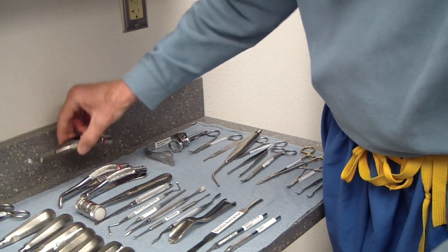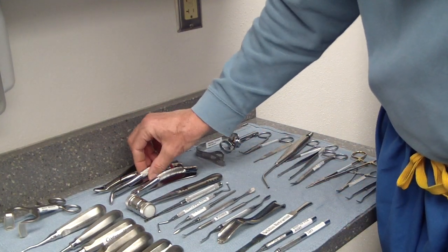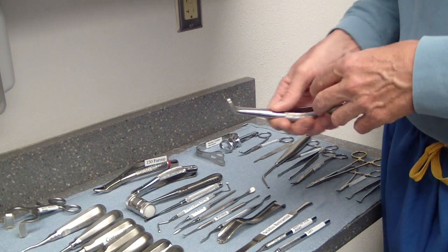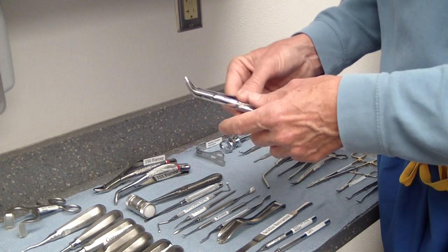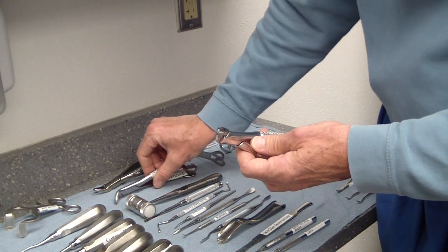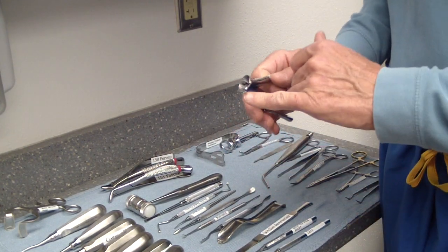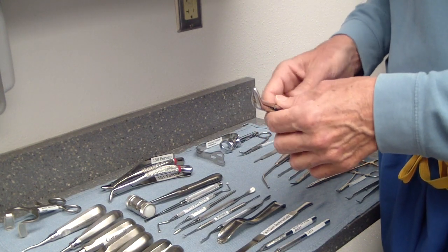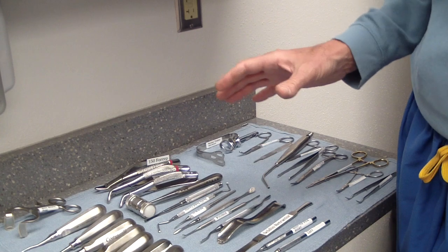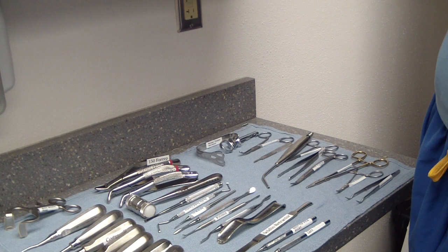Our standard forceps include the 150, which is pretty universal for most upper teeth and even a few lower ones. The 151 has a slight angle, making it good for lower teeth. I also like the 151S, which looks like a 151 but smaller — a pediatric instrument. The nibs are smaller, which is especially useful for maxillary thirds where it can be hard to get the 150 all the way back. If you have a large coronoid process or buccinator muscle, the 151S gets into tight areas much easier. For specific teeth, you'd also add forceps like the 23 or the 65 for bicuspids.